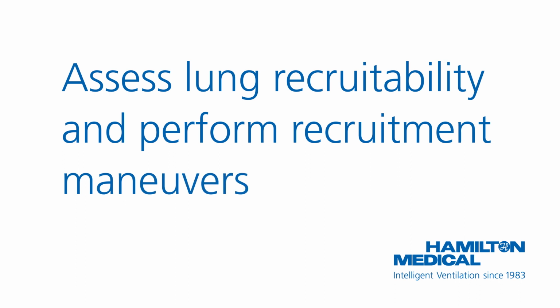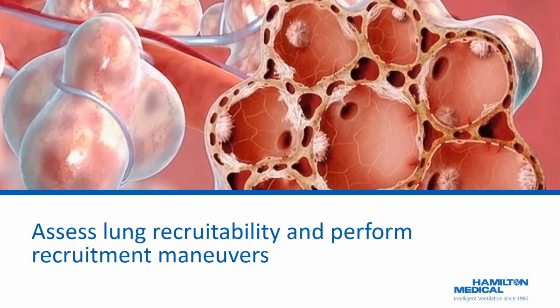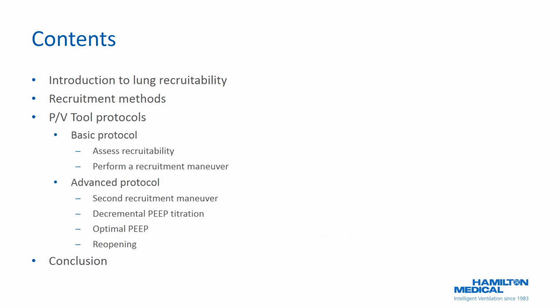This is a presentation on how to assess lung recruitability and perform recruitment maneuvers using the PV Tool option on Hamilton Medical ventilators. The contents will consist of an introduction to lung recruitability, recruitment methods, and associated PV Tool protocols in the form of a basic and advanced application.